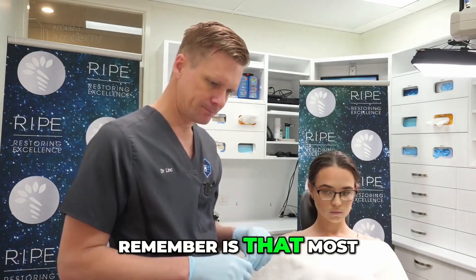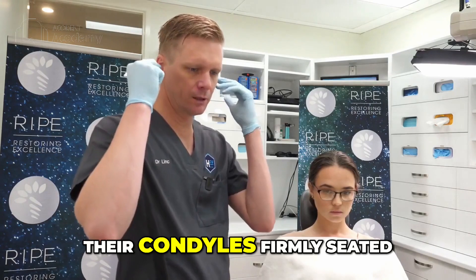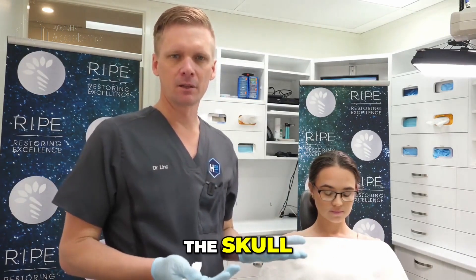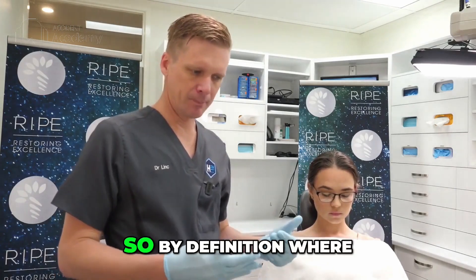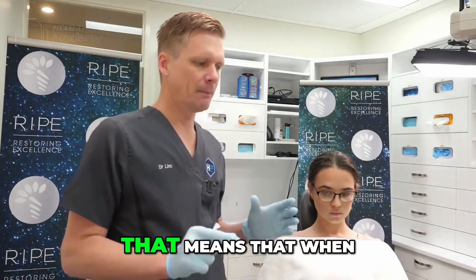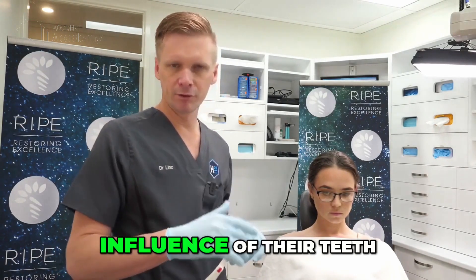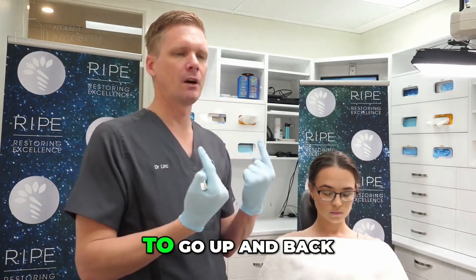The key thing to remember is that most people don't function with their condyles firmly seated against the base of the skull. They're down the eminence a little ways, so by definition, where they're functioning is not usually in centric relation. That means that when you open their bite up and remove the influence of their teeth and ask them to bite hard, the condyles are going to go up and back.